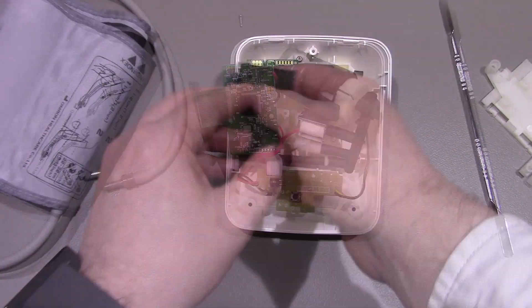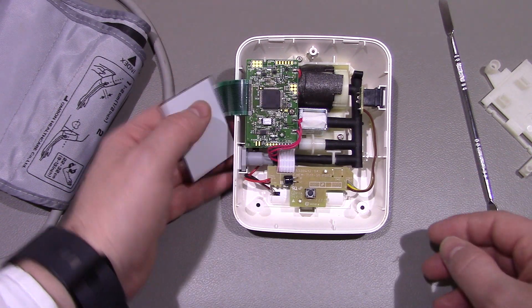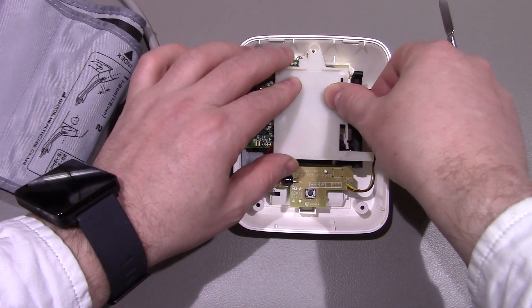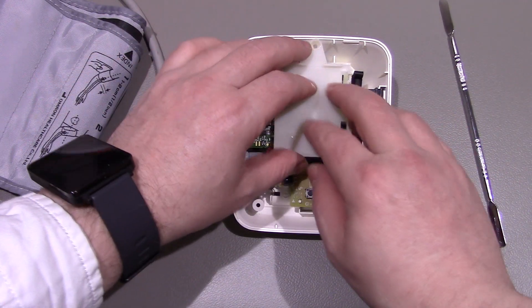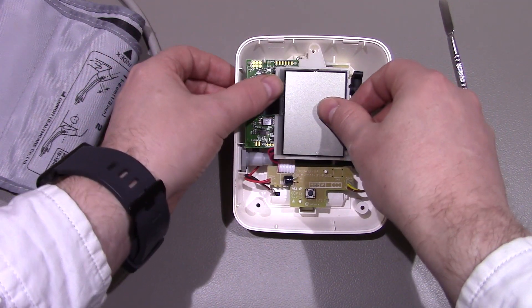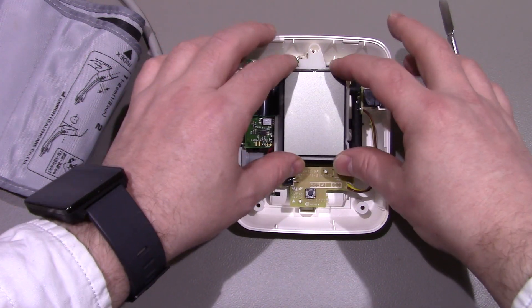We'll pop this back together now. There are different models of this that have logging as well, so you can take various readings and get it to remember - I don't know how many, maybe 10 or so previous readings. Now I've had a closer look at that chip and there's no writing on it at all - I think they've obviously decided to grind that off.